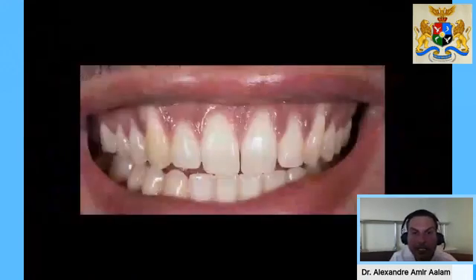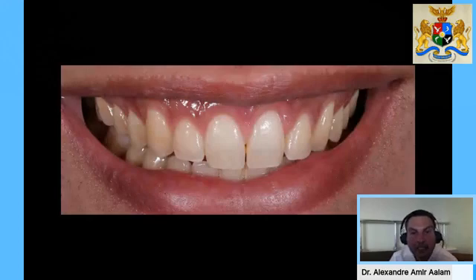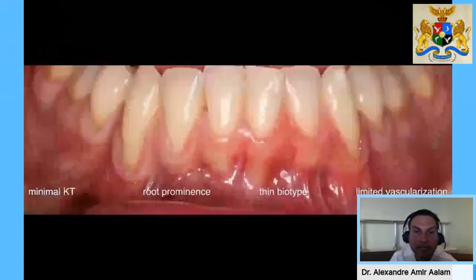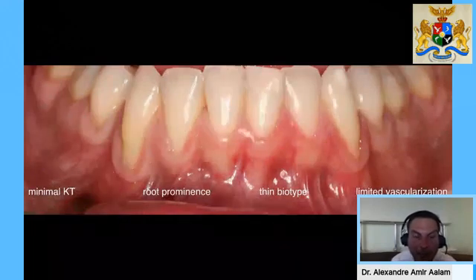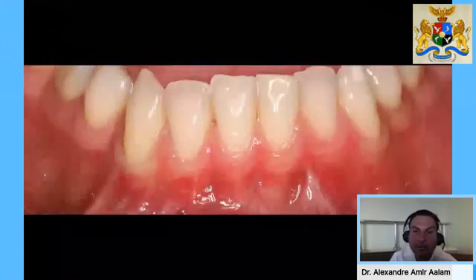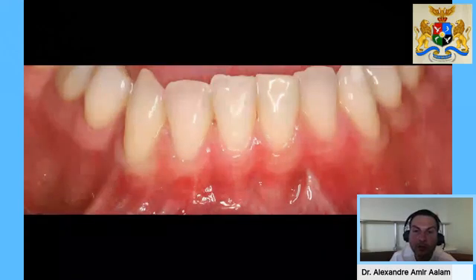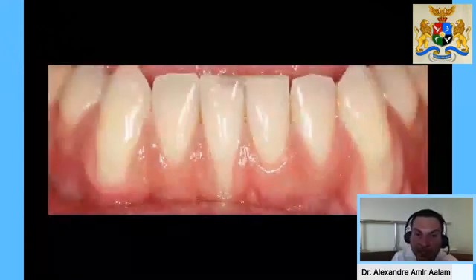This is again the patient you can see at the time of the surgery, and not only the functional benefit of increasing this biotype, but as well the aesthetic improvement that this patient is benefiting from now, having better aesthetics. We have again the same concept applied on the mandible, following the same concept of biotensegrity and volume, making sure that we have some sort of keratinized tissue to begin with, because again, understanding that its absence will become a big contraindication. We see we're able to rebuild a proper amount of attachment around those roots and improve the long-term longevity, not only from a dental aspect, but as well from a periodontal aspect of this patient.